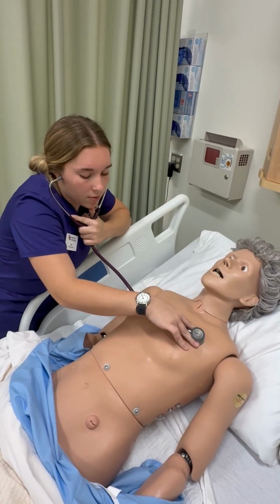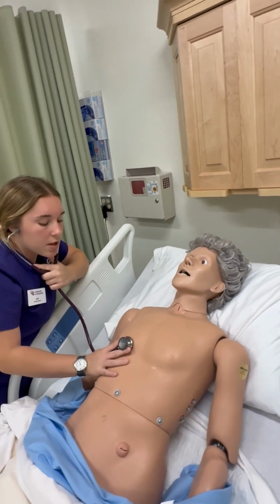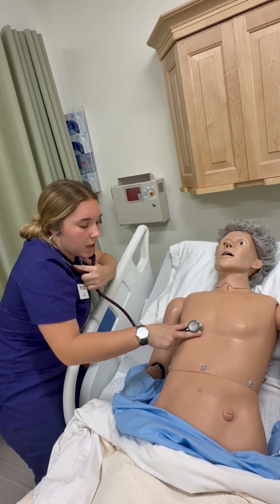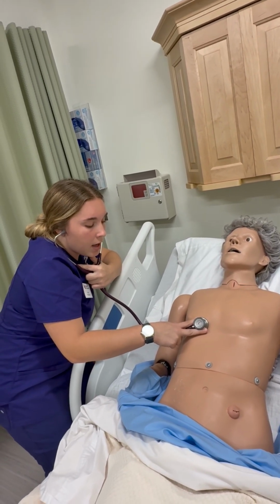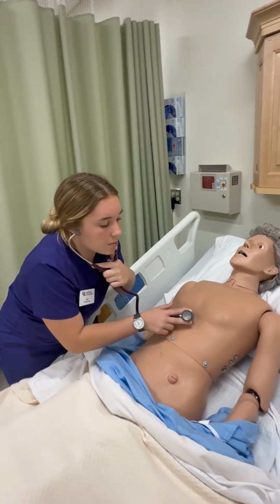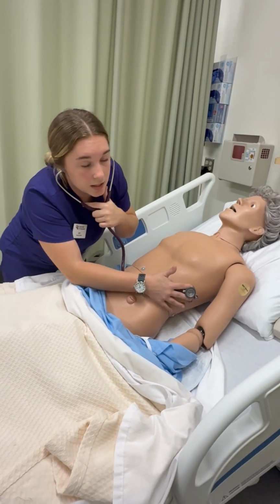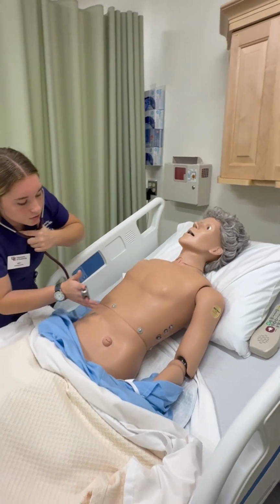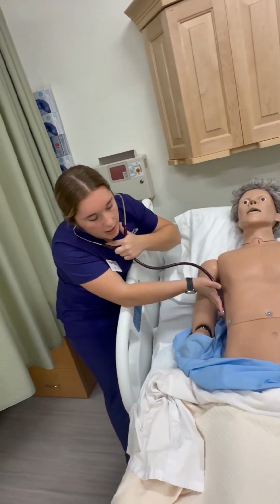From here, I'm going to move over to the right middle lobe, which is around the fourth intercostal space, close to the mid-clavicular line. From here, I'm going to listen to the left lower lobe, which is in the midline of the axillary. From here, I'm going to listen to the right lower lobe, which is also in the midline of the axillary.